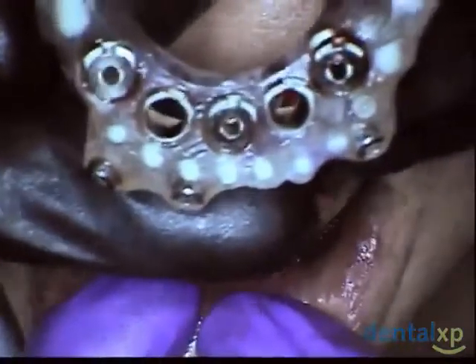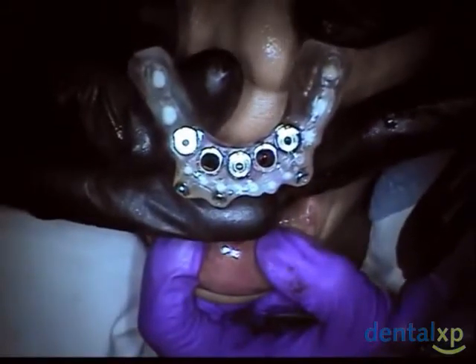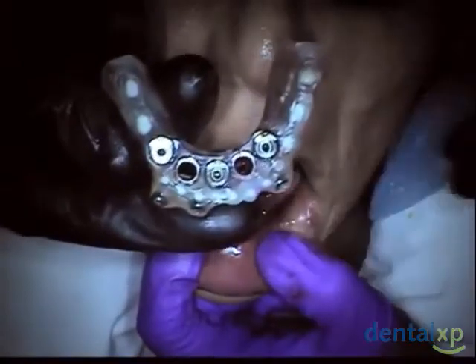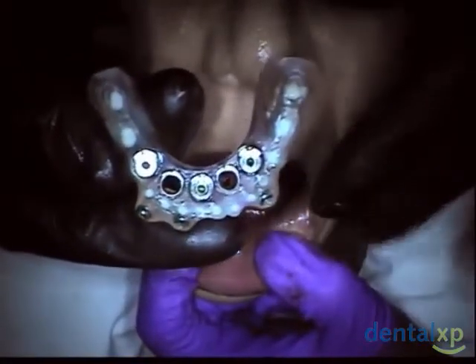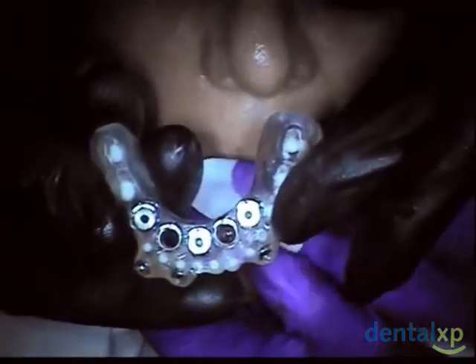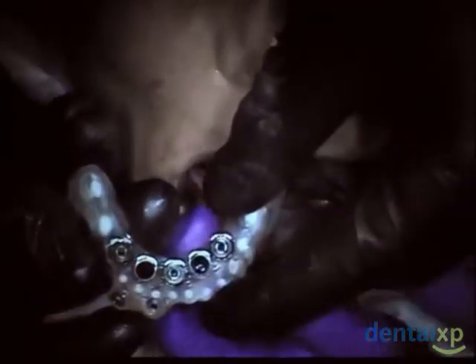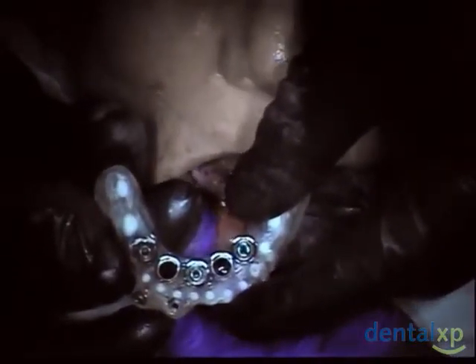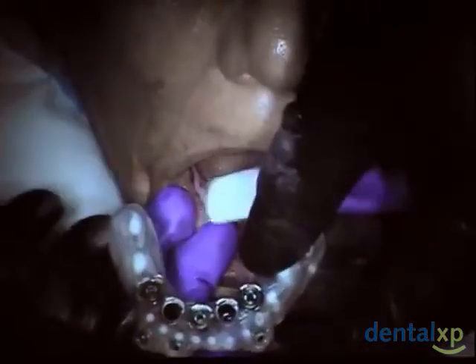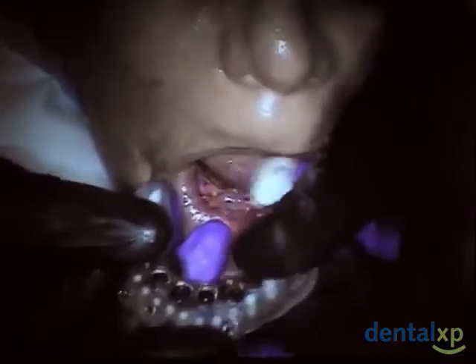What we've done is now we've taken the 1.6 guides out and placed the 2.4 guide in only in the areas that we're going to be using. You see I've removed the 1.6 in the other areas because I want nothing to happen that it'd be possible to go into the osteotomy in the wrong position, since it would be too large for a 2.2 implant. So basically I feel that we've gotten where we need to be. We may have to tap, but we'll determine that after we go to the next step. Again, we're going to reposition this right where we were before and take our osteotomy to depth.